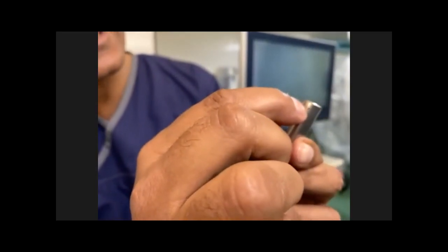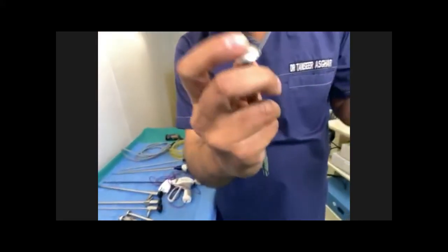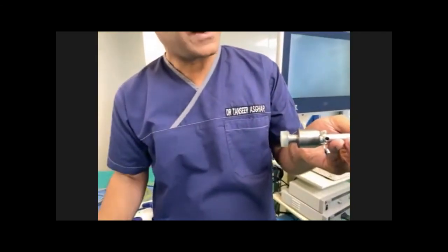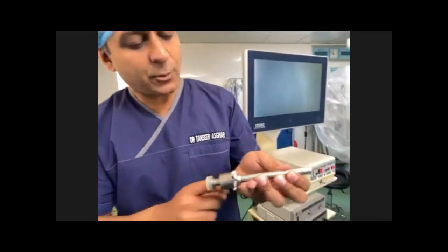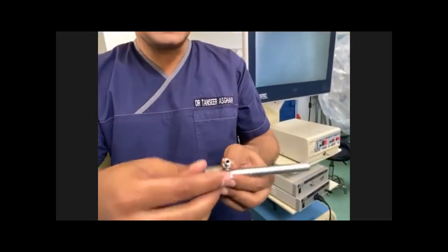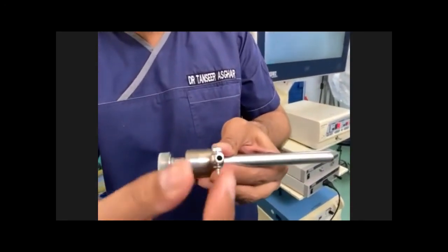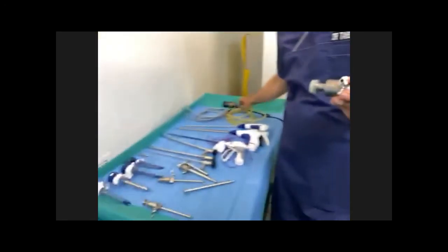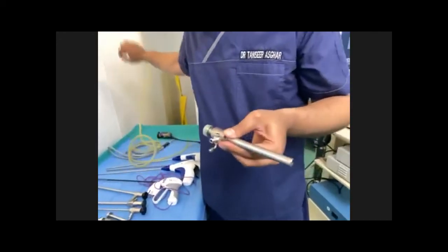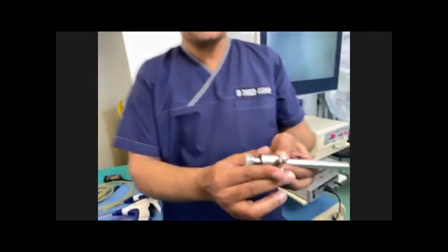When you go in, the carbon dioxide gas, which is used for insufflation, goes in, and there is another hole over the trocar, and you hear a hissing sound that you are inside the abdominal cavity, right? When you are putting the second or third trocar. So it has a shaft, and there is a valve over here through which you can attach the gas through the pipe, right? And you can switch it on and off from here.